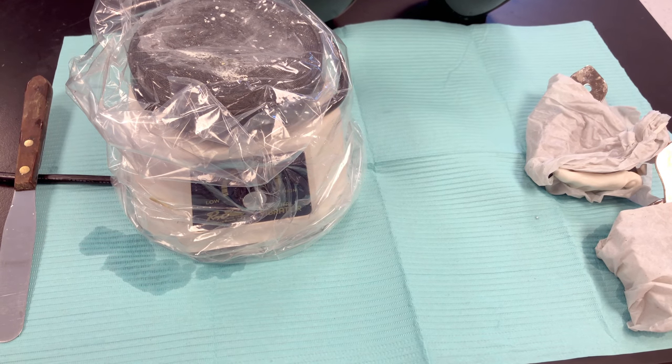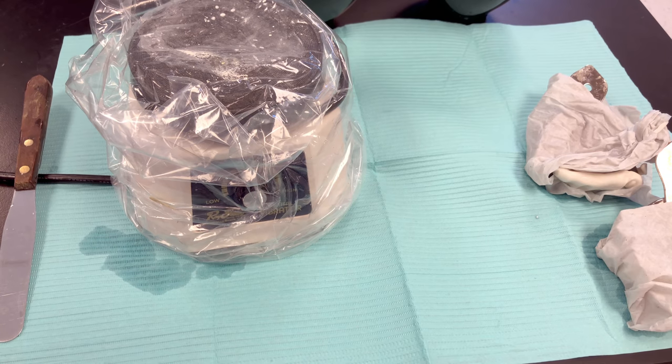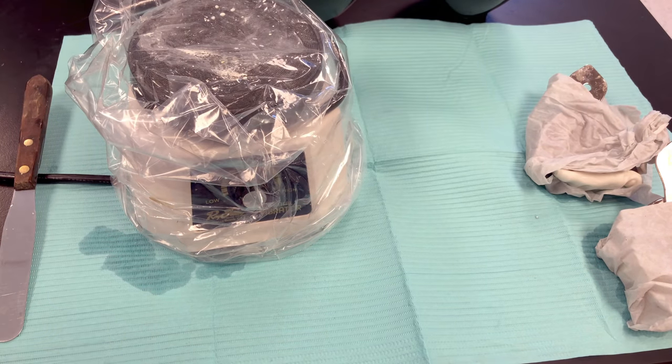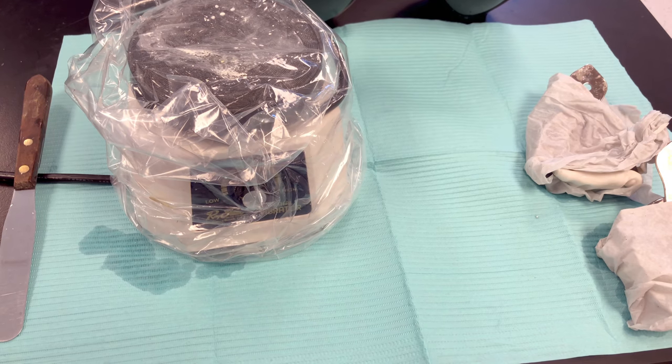Hi everyone! This video will demonstrate how to mix and pour up your plaster models using the impressions that we took earlier. We're using our alginate impressions and we will be using what's called the inverted pour technique.